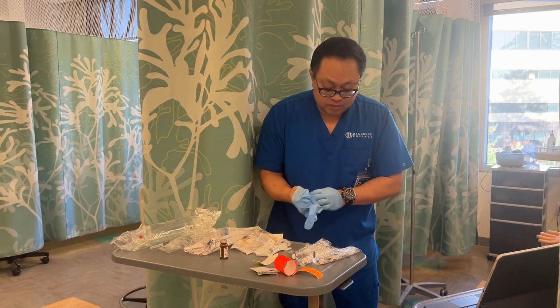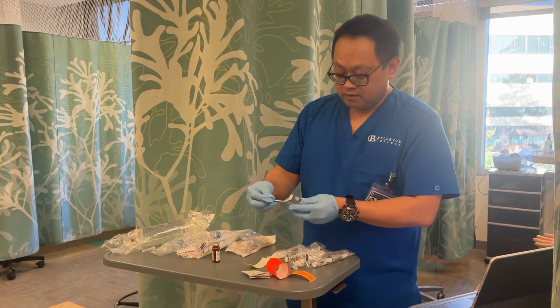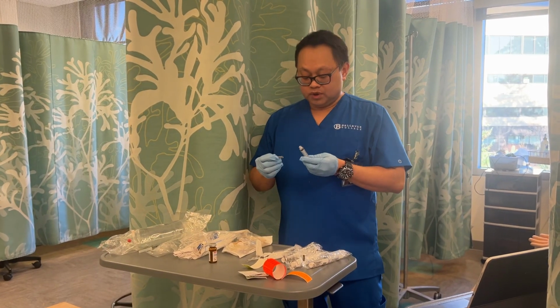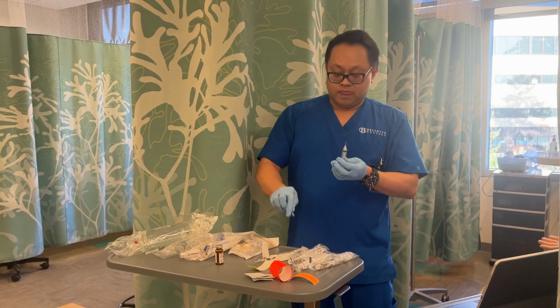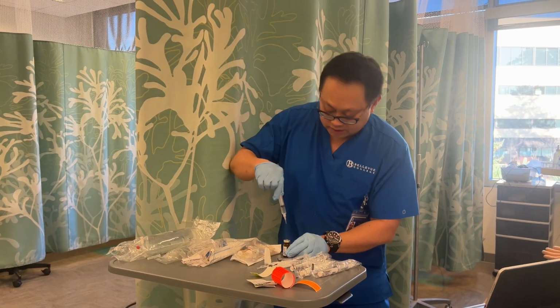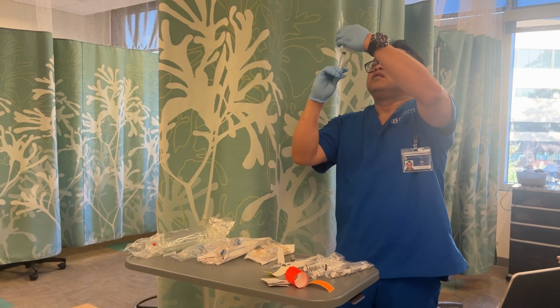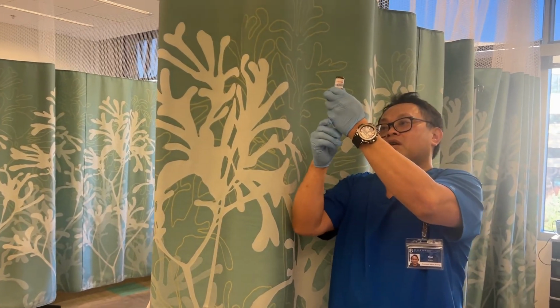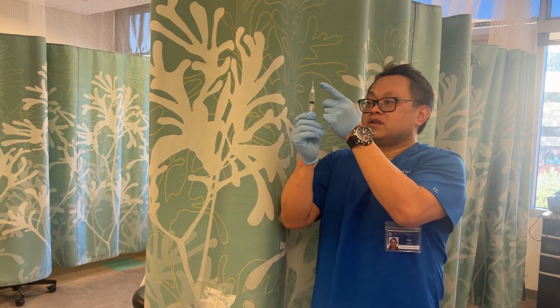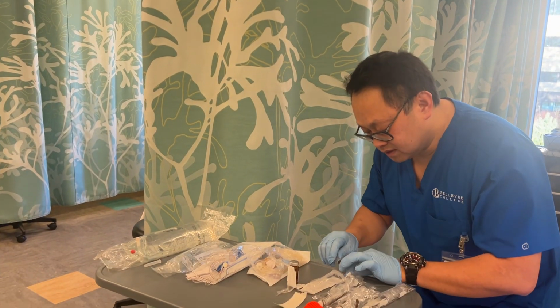So now I'm going to pull my medication, and I'm going to start with the ondansetron, with the IV push. I'm going to withdraw more than 2 milliliters of air. Okay. I'm going to inject air into air. Push air out. I'm going to tap all of the bubbles. I'm going to withdraw a little more than 2 milliliters, and then I'm going to tap again for bubbles, shoot out a little extra if there's air bubbles. I'm going to recap this.